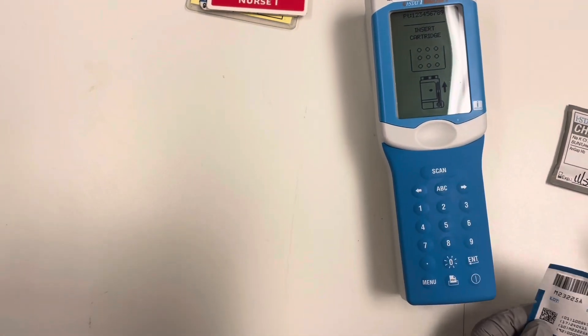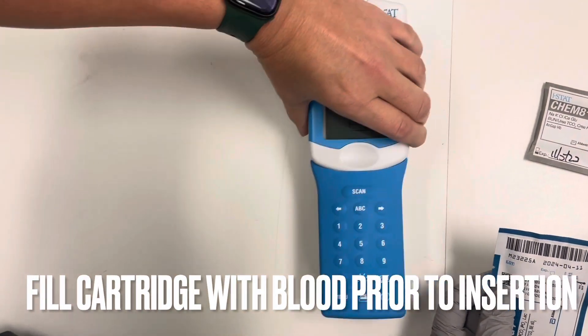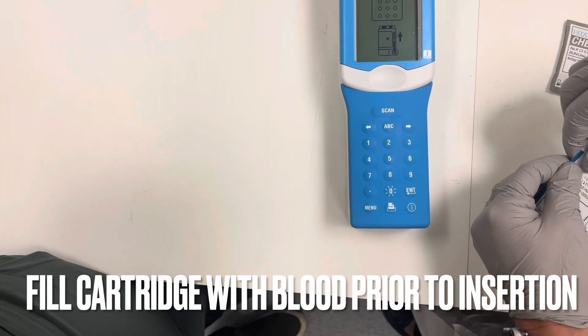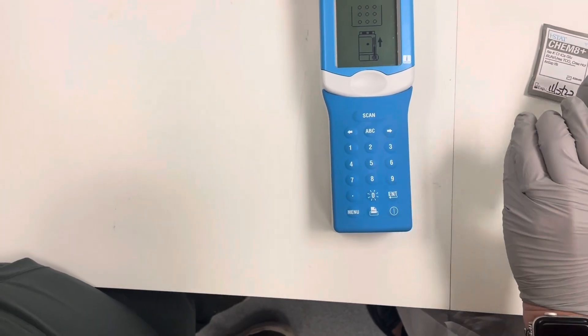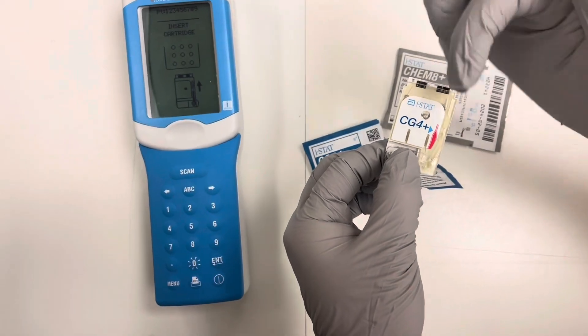It says insert cartridge. We want to make sure we fill our cartridge with blood before we insert it. So we are going to open our package, only touching the bottom and the sides — never touching the top or the center.